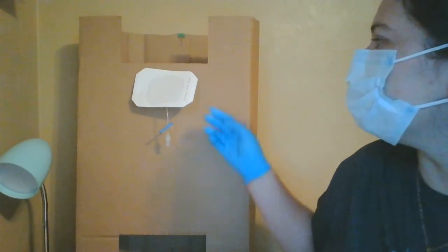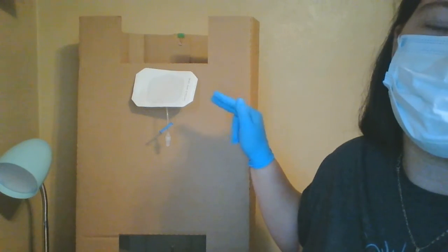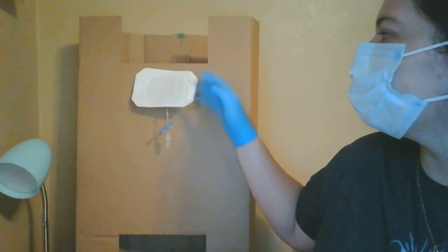And you also want to lift up the original dressing from the skin a little bit. This just makes it easier while you're doing the actual procedure. So when you remove that, it'll already be kind of off of the skin. So now since we've inspected the original site, we can go ahead and take off our gloves. You also just want to keep what it looked like in mind because we will have to document it later.